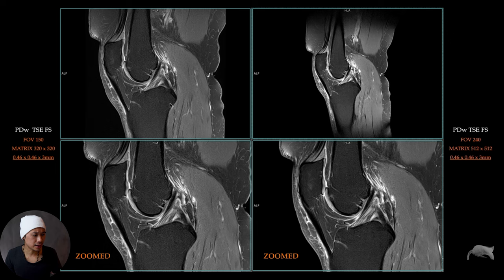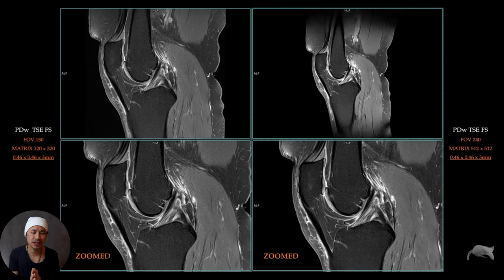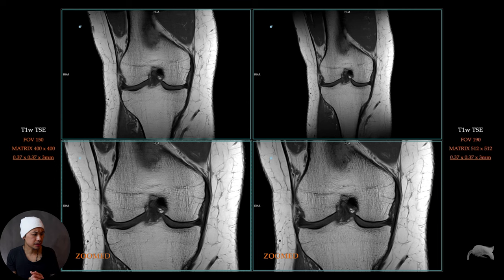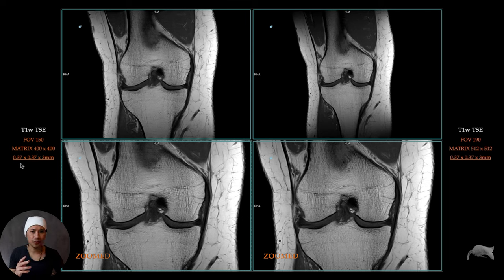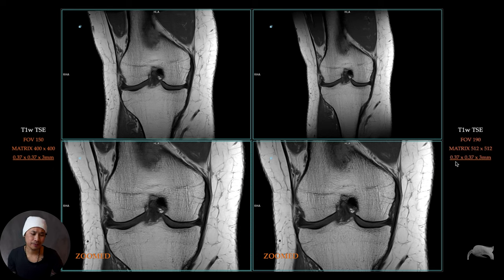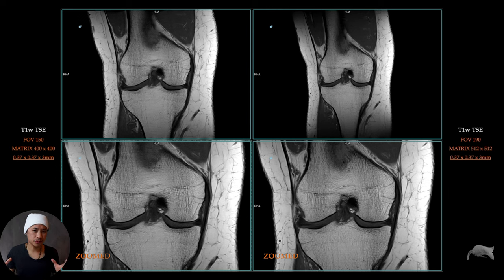The outcome of the images is totally different — you don't want to scan a knee with a very large field of view; you want a dedicated small field of view. But if you zoom in, the resolution is more or less the same. You understand now: the matrix doesn't matter if you don't know the field of view. There's another scan here — a T1 spin echo — with a 150 field of view and matrix 400, so 150 divided by 400 is 0.37. Over here, increasing the field of view to 190 divided by 512 gives the same result.